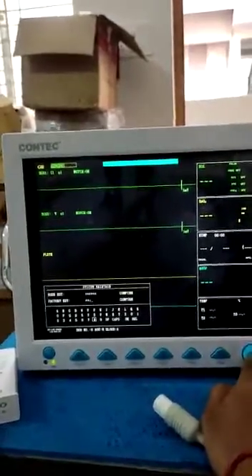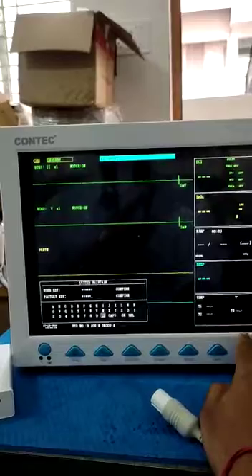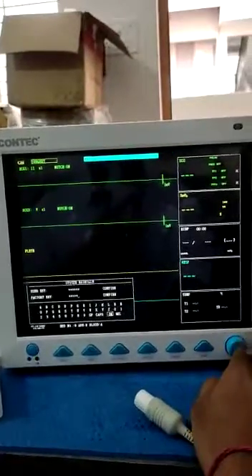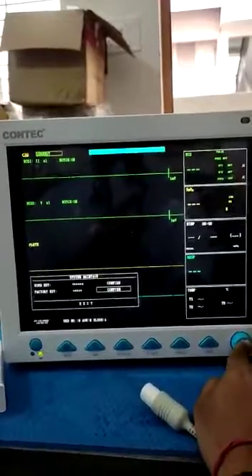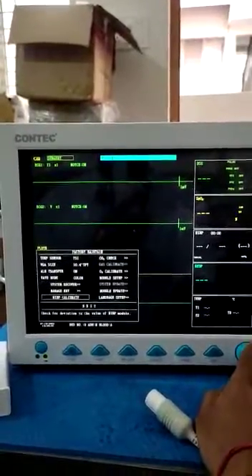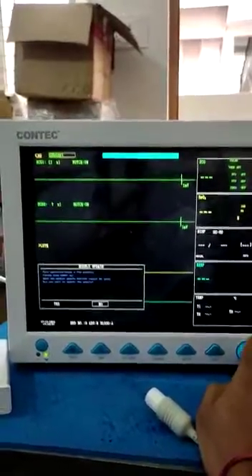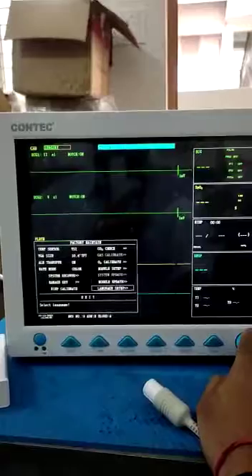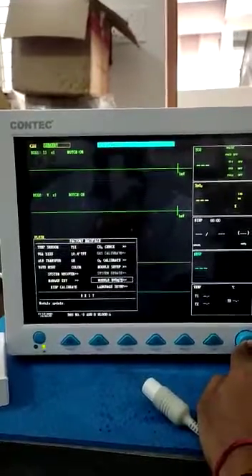Go to System Setup, then System Maintenance, then Factory. It will ask for a password — the password is five times eight. Confirm to enter the factory maintenance menu. In factory maintenance, go to Module Setup.